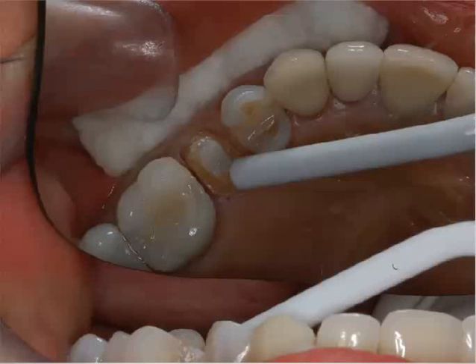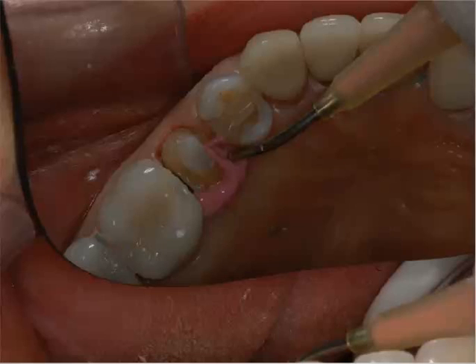But now once we remove that cord gently, we don't want to just rip it out. They usually stay moist. We're not going to tear the sulcular epithelium. But if you have any residual material or debris left there, you want to clean it up, simply rinse it, air dry it real quickly with your Tri-Plex. Then we're going to take our light body impression material.